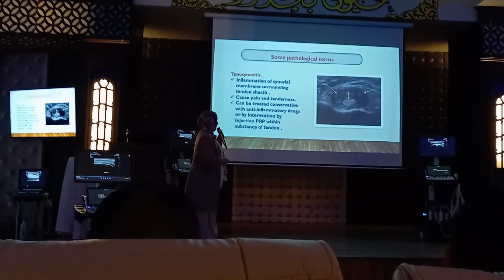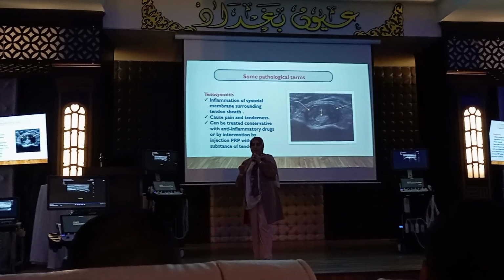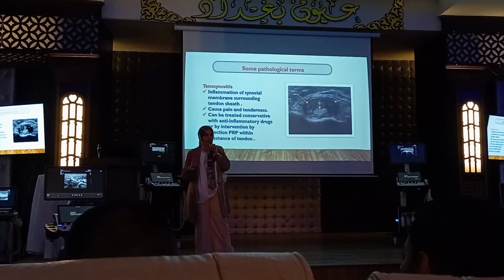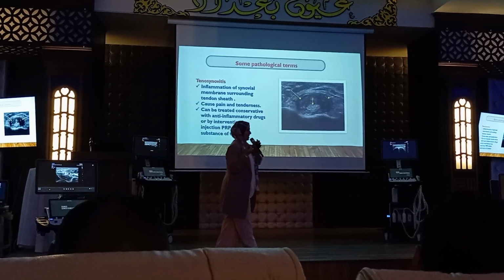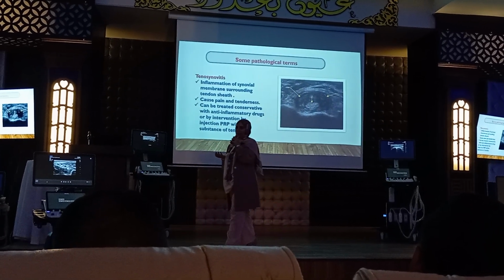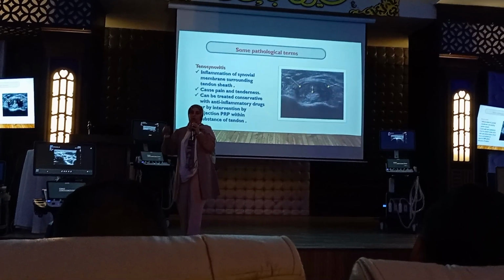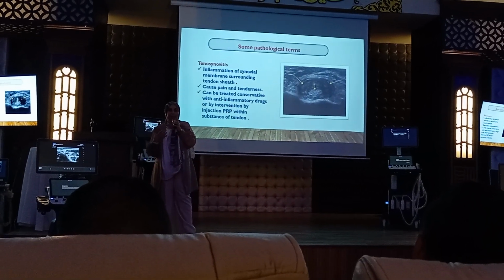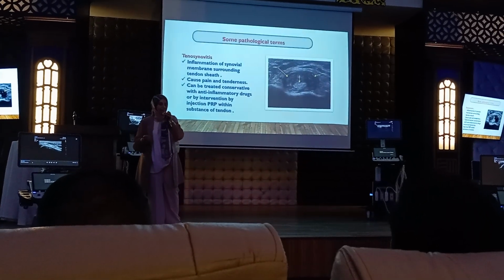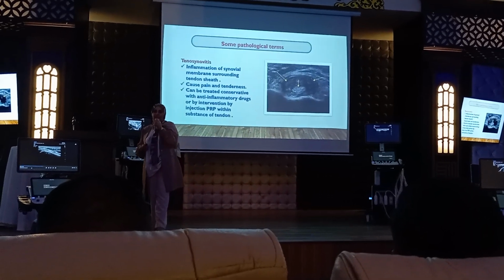Now some pathological terms. What is meant by tenosynovitis? Every tendon and muscle is surrounded by a synovial membrane, a synovial sheath, containing just a few ml of fluid. We can see it by ultrasound. So if this synovial sheath surrounding the muscle or tendon is thickened and becomes hypoechoic, and when we open power Doppler or color Doppler, we see increased vascularity, this is called tenosynovitis.